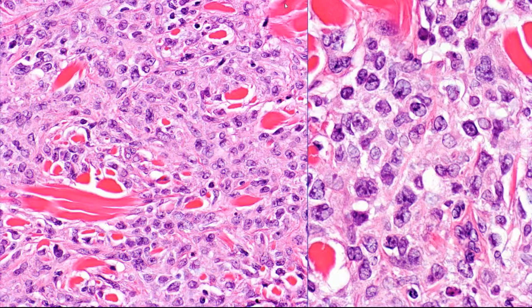So they're certainly larger than normal small lymphocytes, and they're overall somewhat irregular, sometimes distinctly lobated nuclei. Sometimes they have elongate nuclei. You can see them here again, this sort of irregular indented contour of these cells.